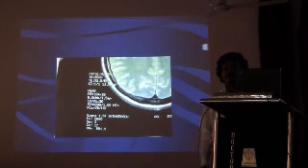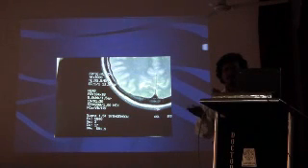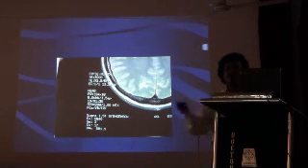T1 or T2 images. This can be changed to some extent. Not that every time we are using TR of 3000 milliseconds.